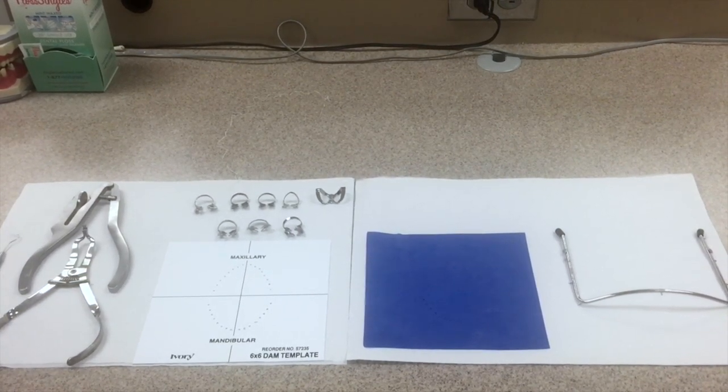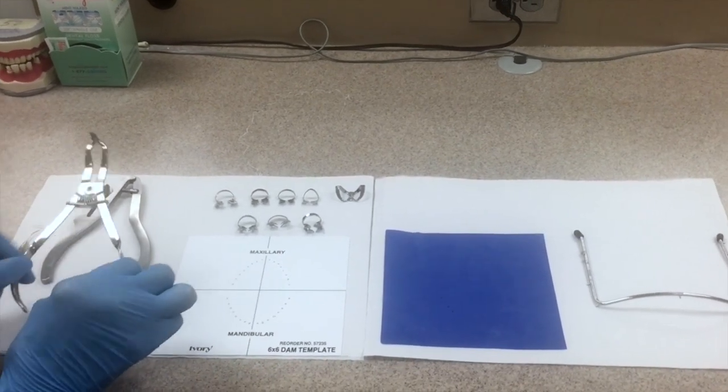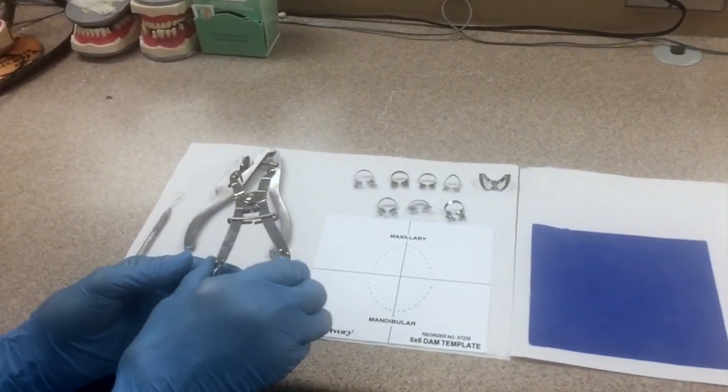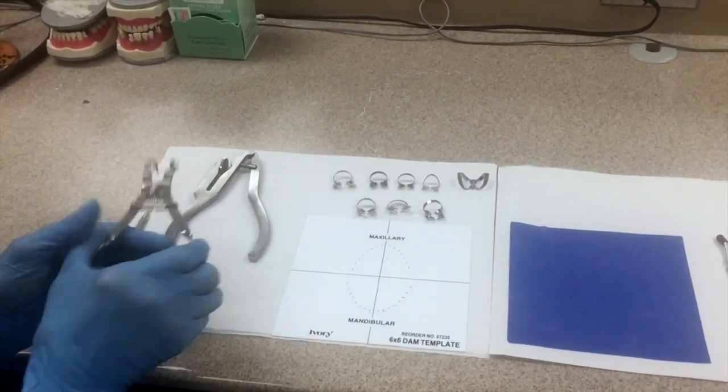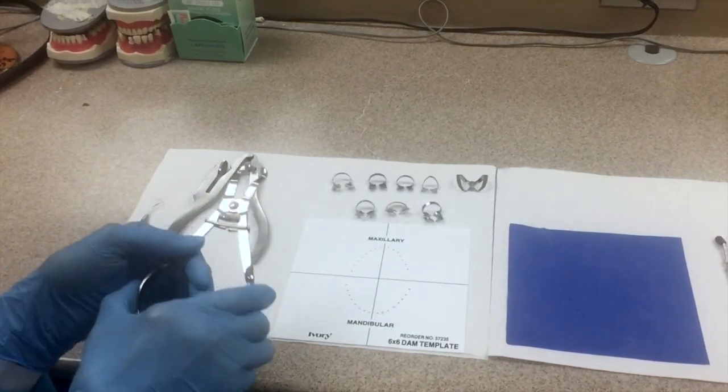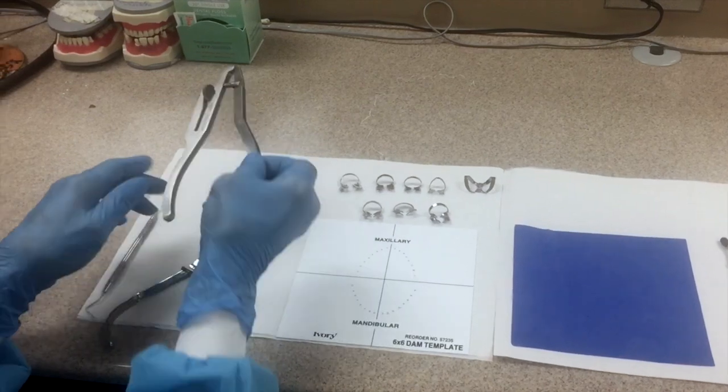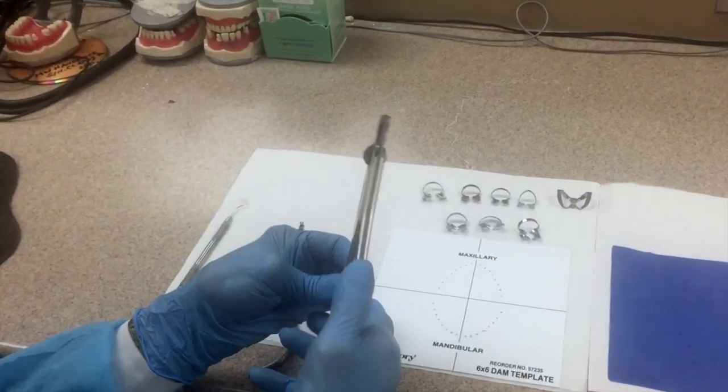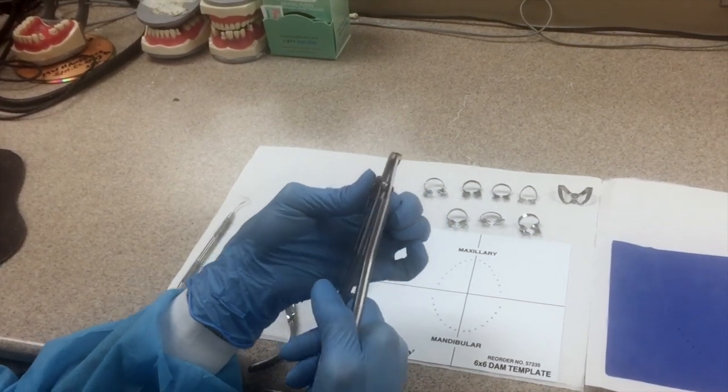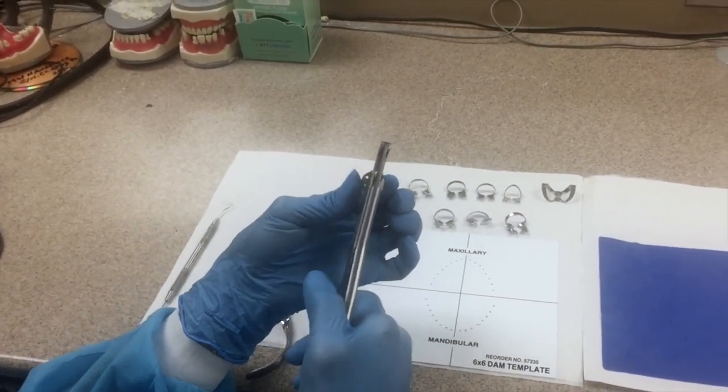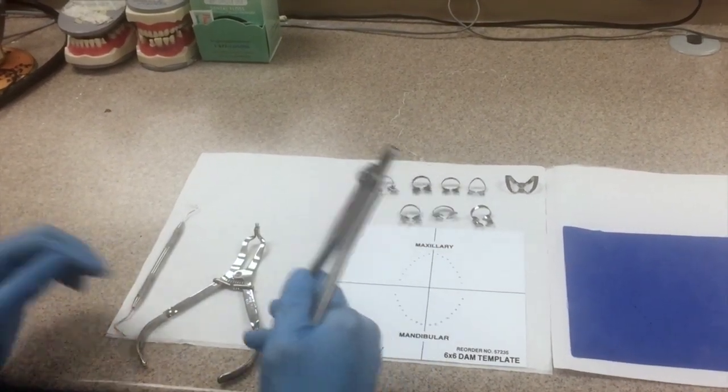First I would like to go over the components of the rubber dam system. First we have our rubber dam forceps, and these forceps are a means of transporting the retainers onto the tooth. Our next instrument is our rubber dam punch. The rubber dam punch actually punches holes in the rubber dam. Big holes for big teeth and tiny holes for little lower central incisors.